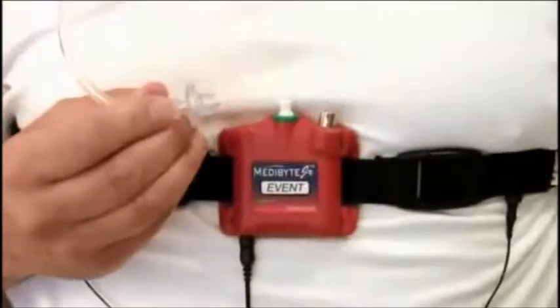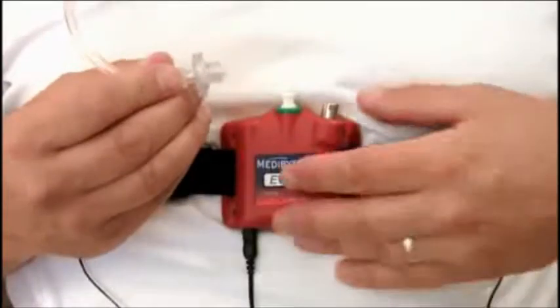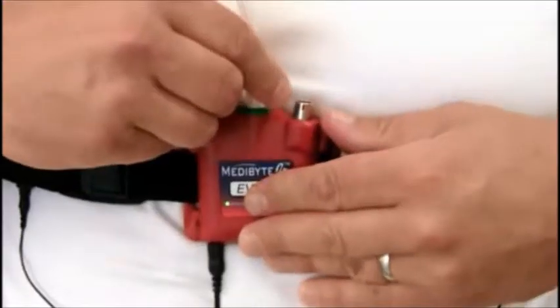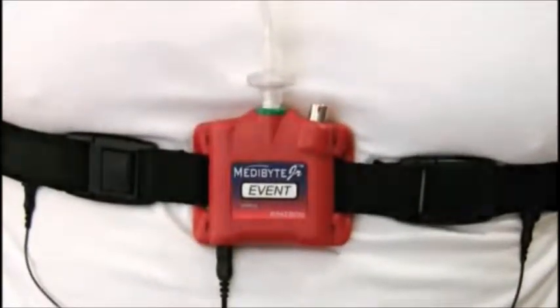Once snug, apply tape on your upper cheek area or wherever comfortable to secure the tubing on your face as needed. You can now attach the connecting end of the cannula into the center port of the MediByte unit, turning it slightly clockwise making sure not to over-tighten the connector.